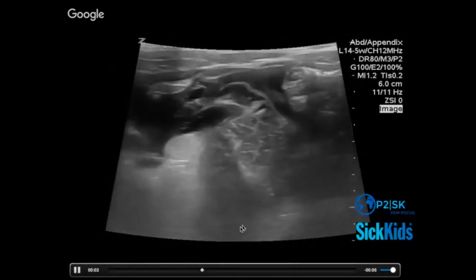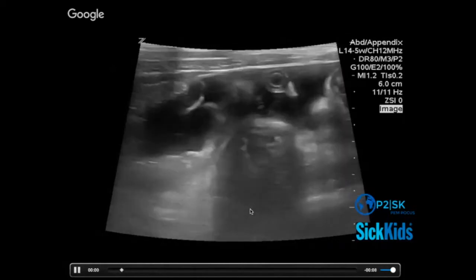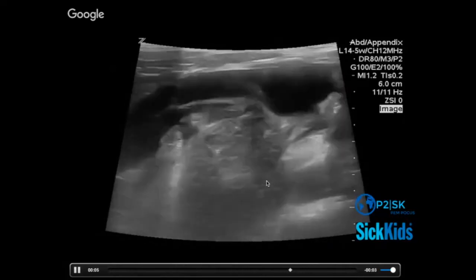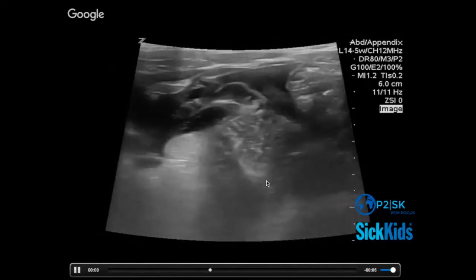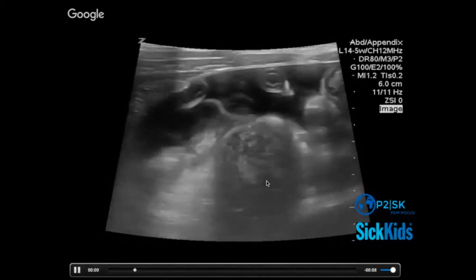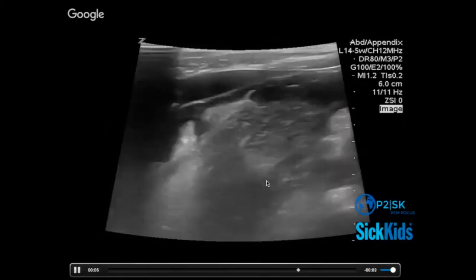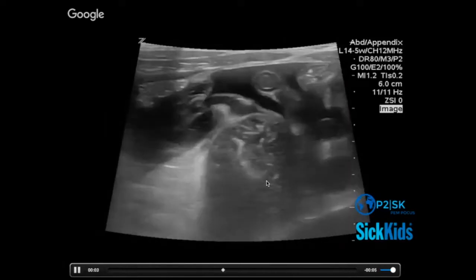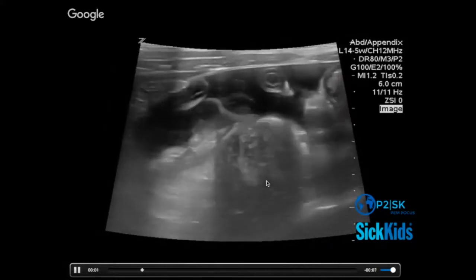So, what's this? And this one's an example. We're going through the spectrum of appendicitis and going to have a bunch more soon that are about perforation. For me, one of the things that's really useful is if I have a really hard time bringing the psoas up to the peritoneum, if there's all this stuff in the way and I'm like, where's the psoas? It's hard for me to see it. I'm pushing really hard. The kid's trying to punch me because of how hard I'm pushing, and I still can't get a nicely defined psoas. There's just so much wall edema. There's so much inflammatory junk going on in the right lower quadrant, and those things really push you towards, you know, this patient is likely perforated.